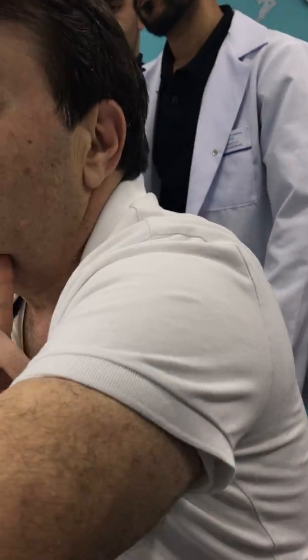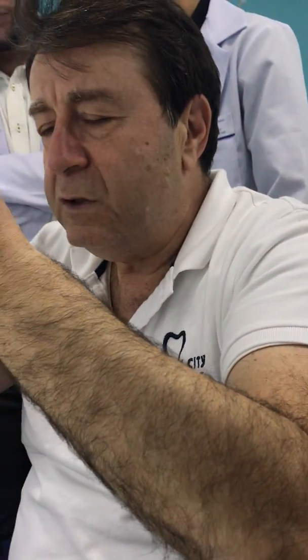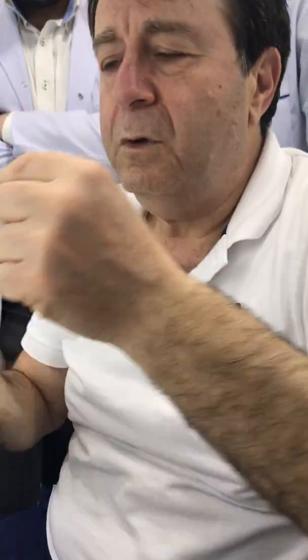This one, it will open a road. You can enter here, you can enter there. You see, it's a pin. If the jaw is broken with children, we do a device in the oral cavity. We enter with the pin here. In the oral cavity, we take the wire and we do circumferential wiring.